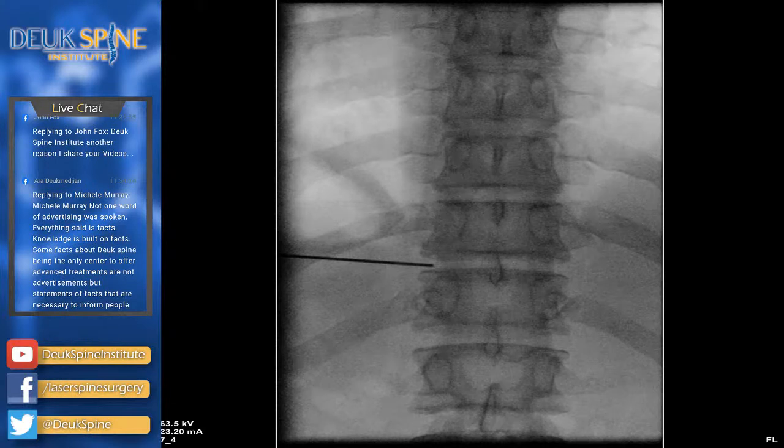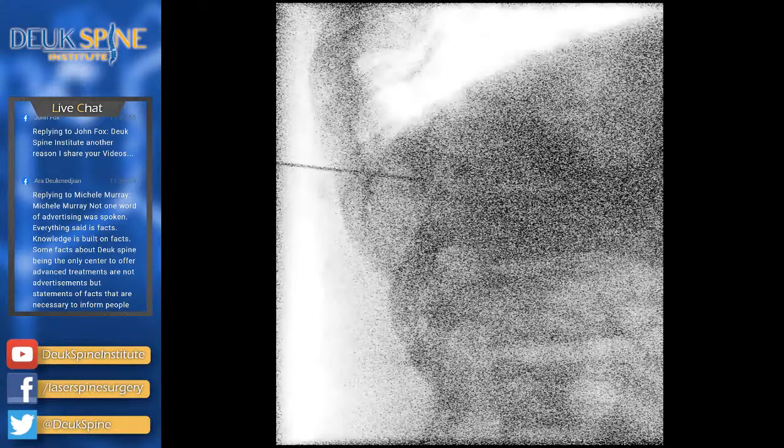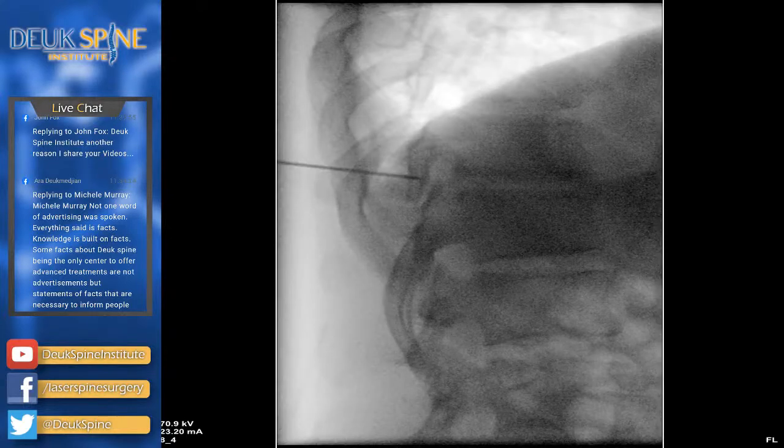Let's go back to a lateral view, please. So it's absolutely perfect trajectory. Couldn't ask for it to be better. Very fortunate, we're below the lung field. You doing all right? Okay.